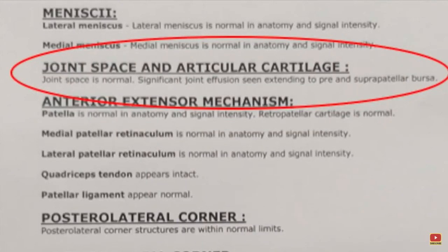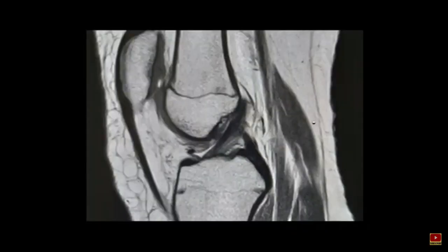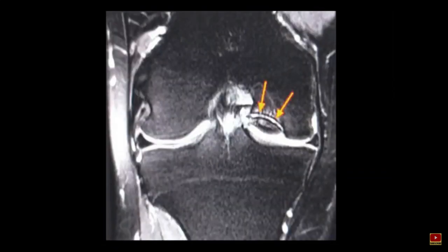Next in the format comes joint space and articular cartilage. Intact articular cartilage looks beautiful in a PD non-fat sat image. We typically examine the articular surface throughout the weight-bearing and non-weight-bearing surfaces. This is an example of cartilage loss in the weight-bearing surface. We have to measure the cartilage defect. We can also have osteochondral defects — we must measure them, assess whether they are separated or not, and determine their exact location.